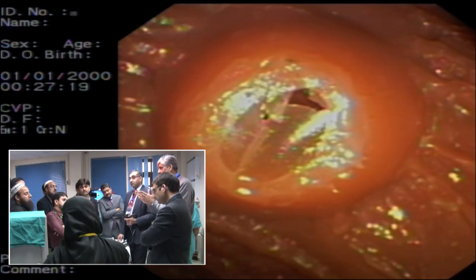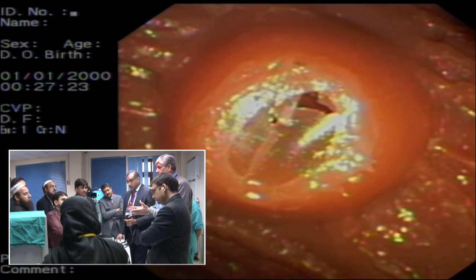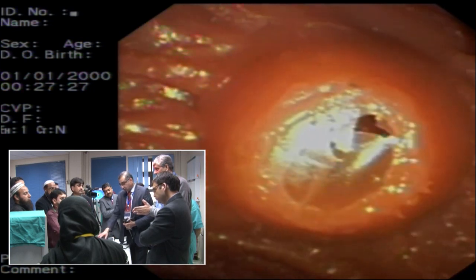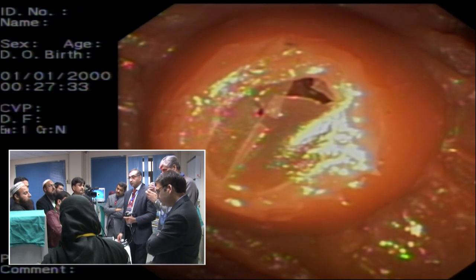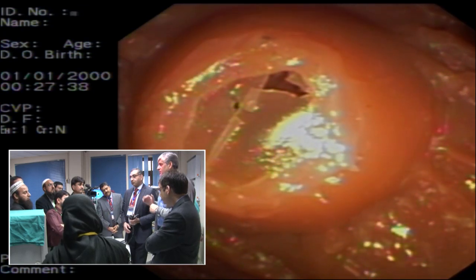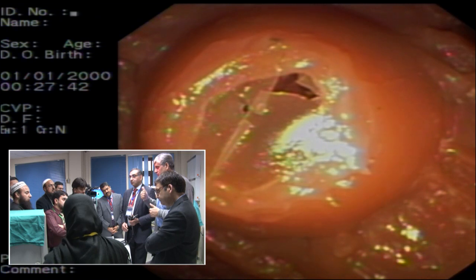These are things you're not going to be told in courses. These are practical things. You have 1 or 2 scopes, you need to be very careful with it. It's not necessary to put stents in every case. A 10 French is different, 7 French is different. If you're really struggling, put a 7 French, save your scope, and let somebody else who has more scopes mess up his scope. So I think that's one thing that's important.